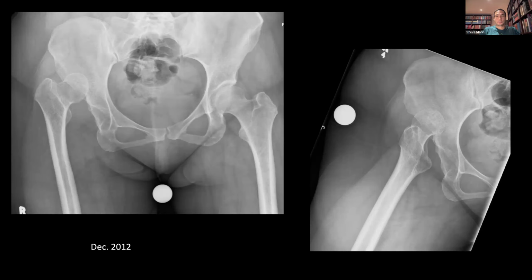Sure. And the cemented implant, like an Exeter style stem that you can control the rotation, would be kind of your go-to. Exactly. When you get the proximal femoral deformity, you can use something like a modular uncemented stem. But again, I'm familiar with cement. It gives me the ability to control height and version with that implant. So that's what I use. Okay, Gavin?